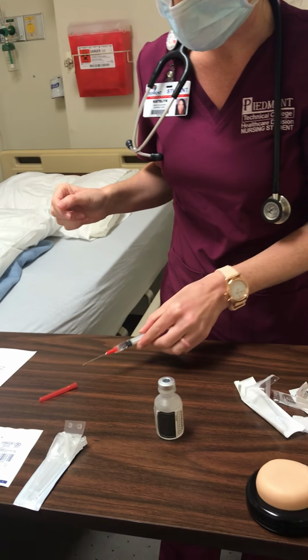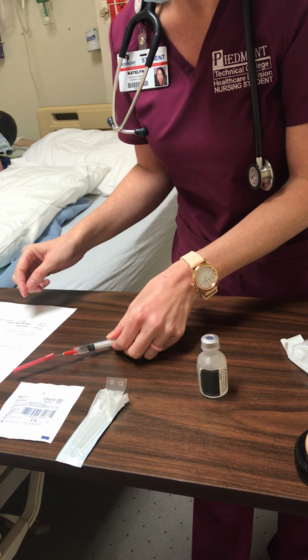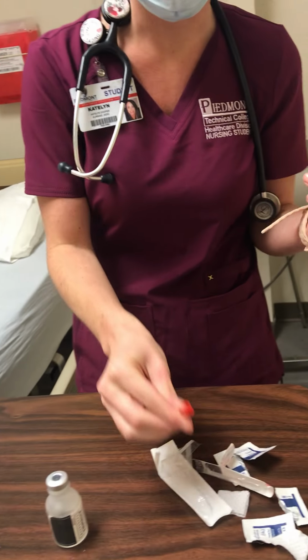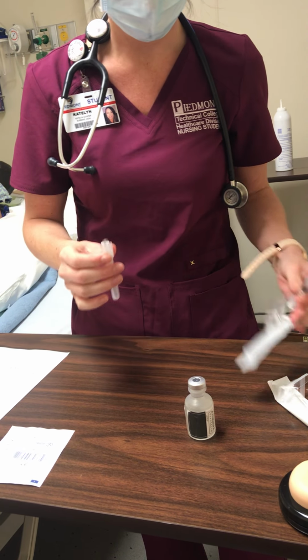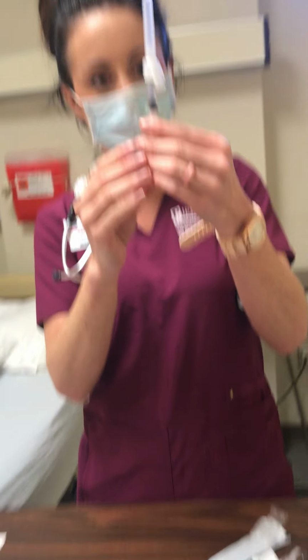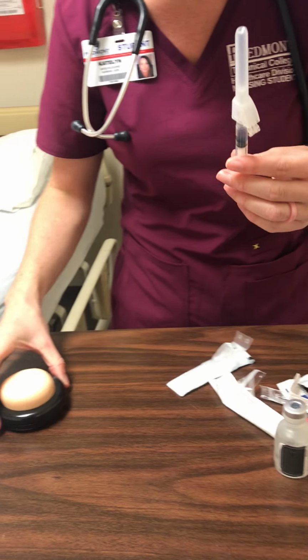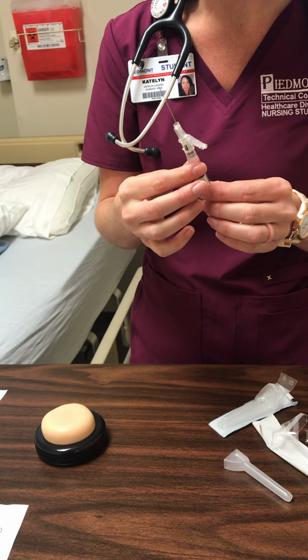Now I'm going to use the scoop method to scoop up the cap. I would discard of this blunt tip needle in the appropriate sharps container. Now I'm going to put my 22 gauge 1.5 inch needle onto my syringe. And again, just make sure that there's no air bubbles.